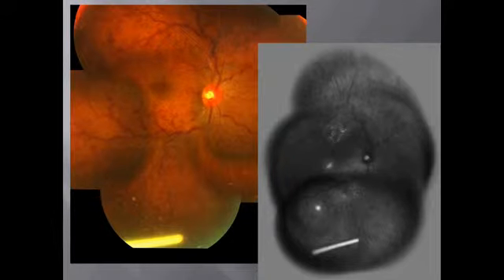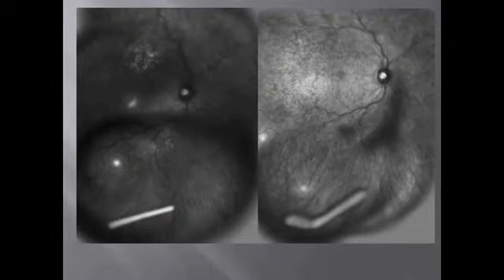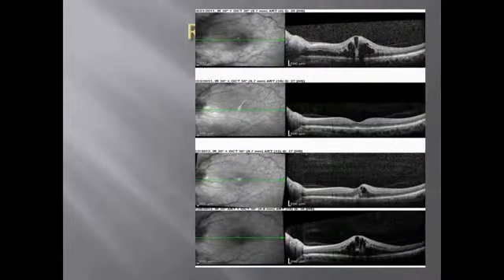This is a patient treated with Ozurdex. Very effective to reduce edema, but then we all know that there is a recurrence in these patients as soon as the effect of the drug goes away. So very typically you get a regression, and then at the third month you start getting it back. So we believe that these patients should undergo some sort of a peripheral mild laser, even if they don't show gross ischemia, if they are recurring. So on a recurrence, what we usually do is we would do a PRP with multi-spots in these cases, a lighter PRP as compared to the ones which we would do for diabetics to some extent. And if you see frank CNP areas, of course, you would treat them the same way.